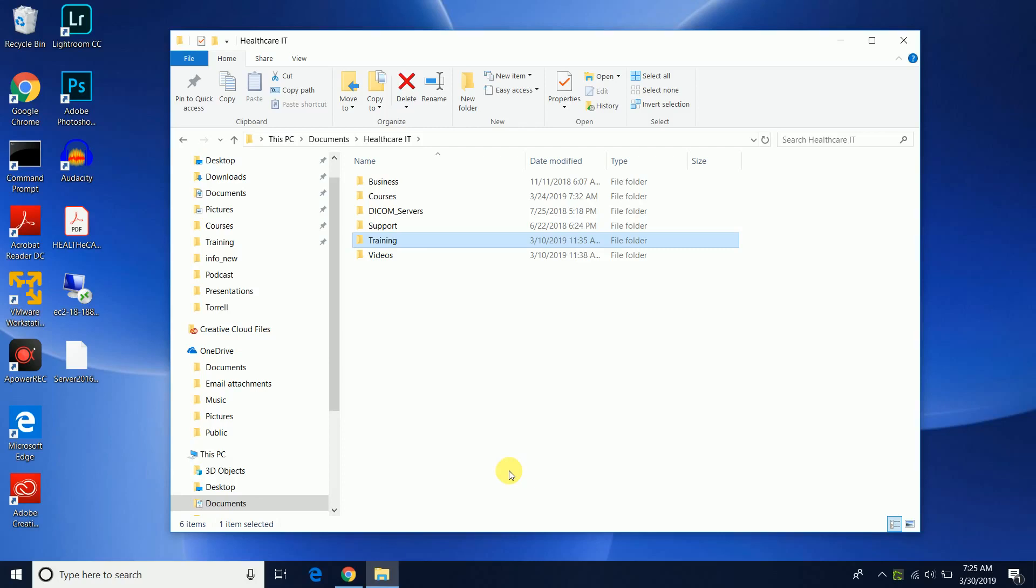Hello, this is Terrell Pauly and in today's video I'd like to show you how to actually utilize the DCM DICOM dump utility from the DICOM toolkit in order to view and display DICOM tags. Now why is this helpful?